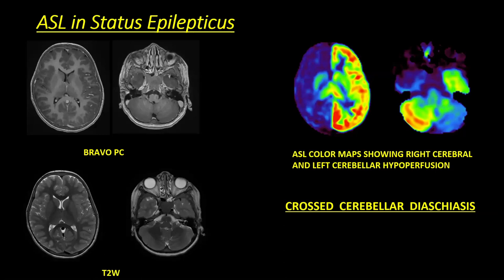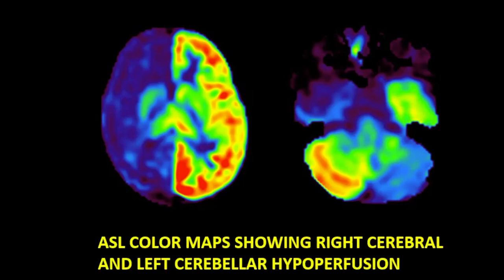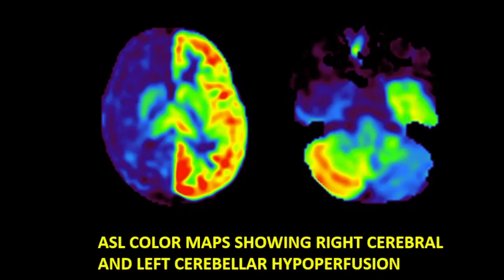Another interesting example: a 22-year-old who came with an episode of seizure. Post-contrast images as well as routine T2-weighted images do not show any obvious abnormality. However, on the ASL color map, there is clear hypoperfusion in the right cerebral hemisphere. At the same time, we see hypoperfusion in the contralateral cerebellar hemisphere as well. This brings us to the interesting phenomenon of crossed cerebellar diaschisis.